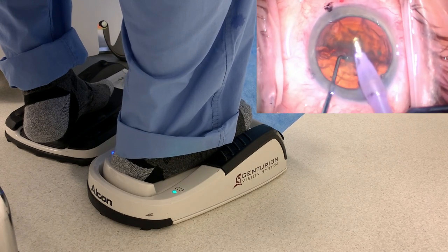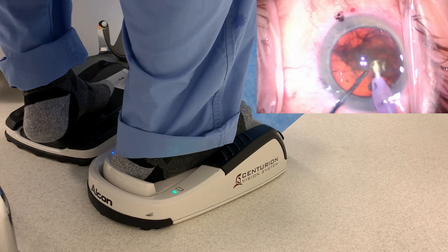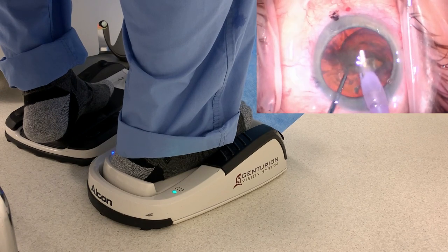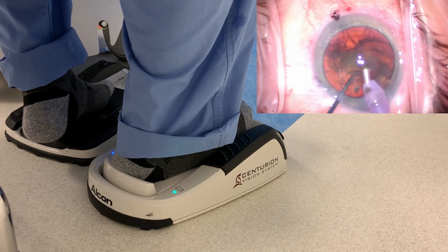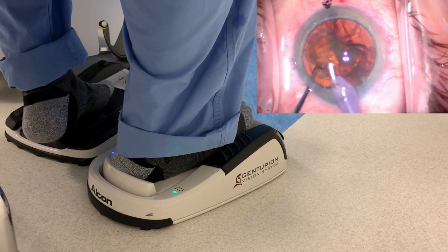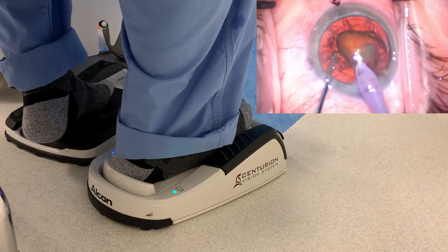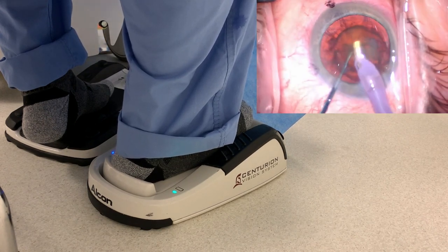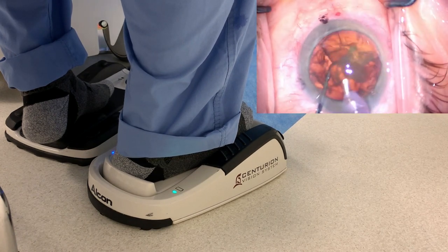I split the nucleus and I'm still on vacuum to bring that piece up. Now we can give energy as well. Just feathering the right foot — notice how the movement of my right foot is slow and steady. It's not a jerky movement; it's a little bit at a time. Now the second piece of the nucleus — bringing it up. I'll go down on the pedal more to give a little more energy. Very subtle foot movements.